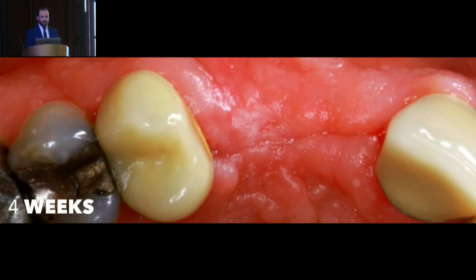This is the follow-up of 4 weeks. We have already retrieved all the stitches. And when we see this case 4 weeks later, we know that unless something major happens, if this patient continues with normal healing, it will likely be a successful case. We already achieved all the principles that we were looking at.